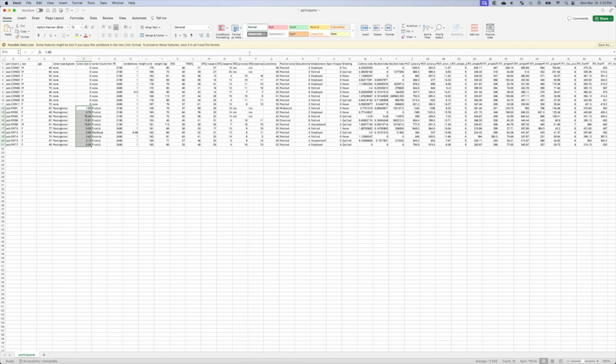We could do something just within our patient group. Is there a correlation between tumor size and functional connectivity? Is there a correlation between smoking status, caffeine intake, alcohol use, all sorts of different things?